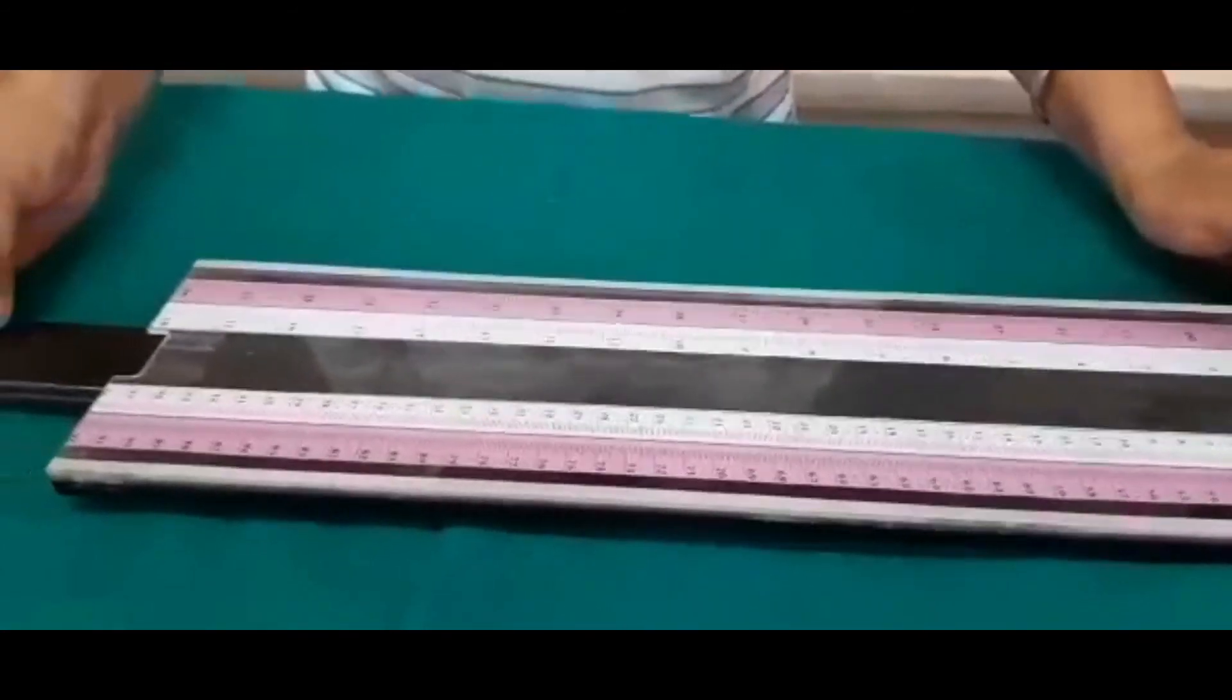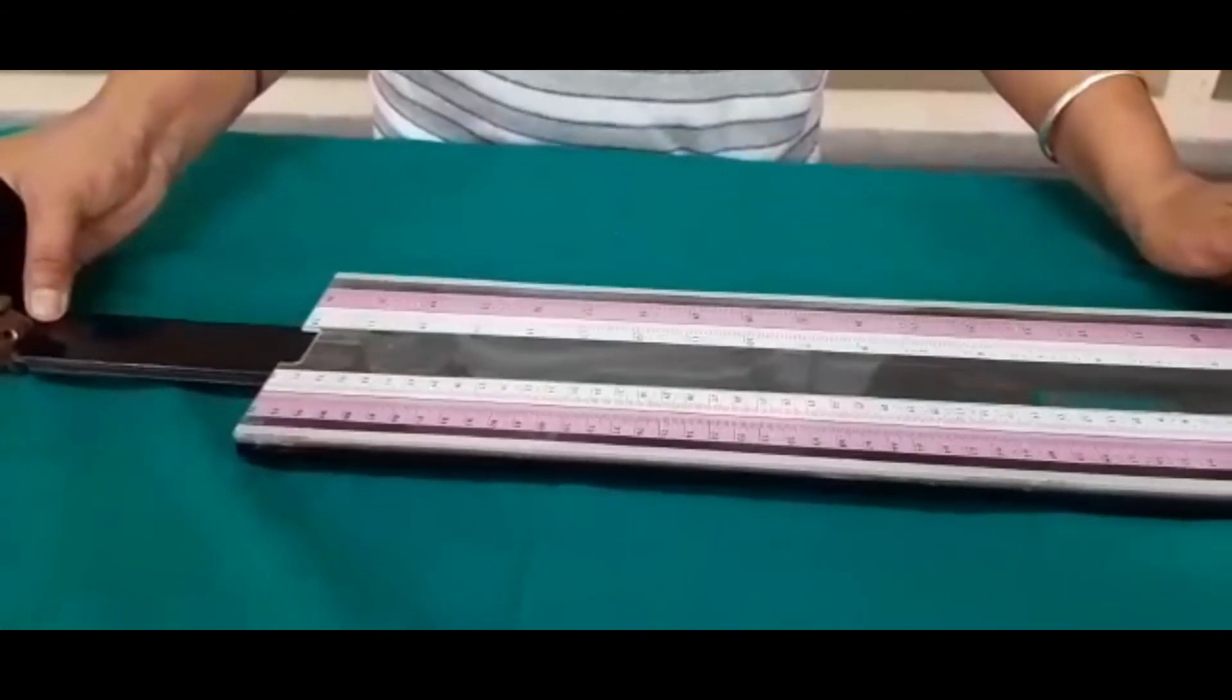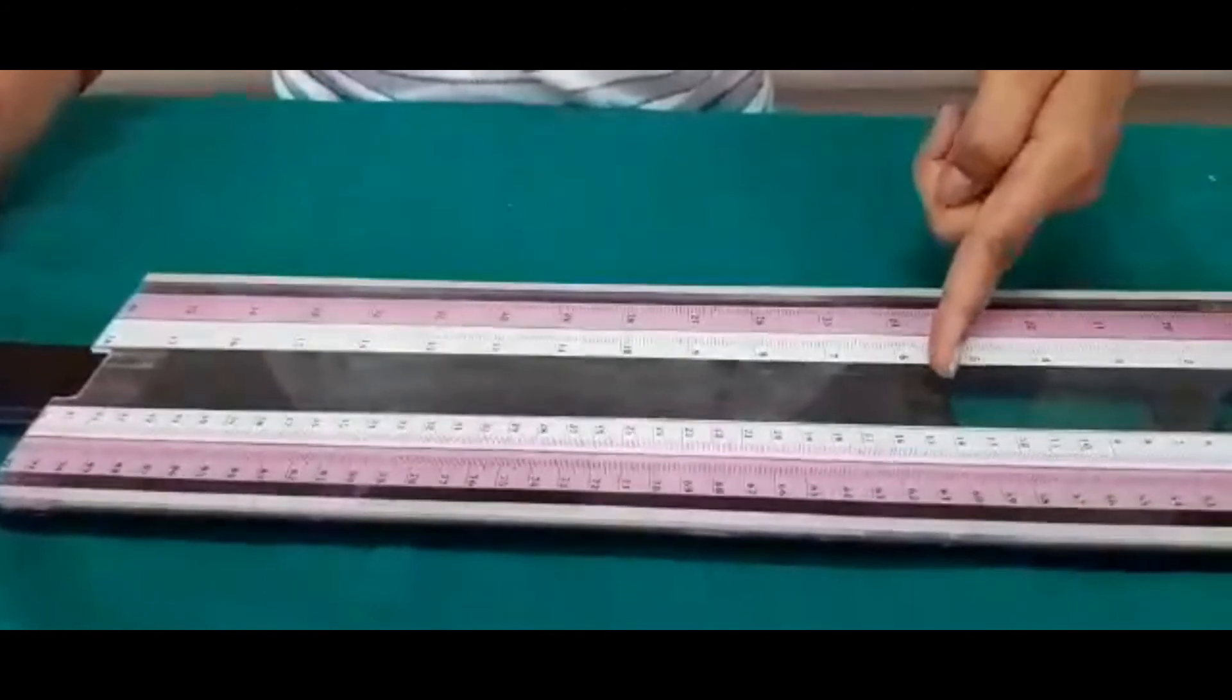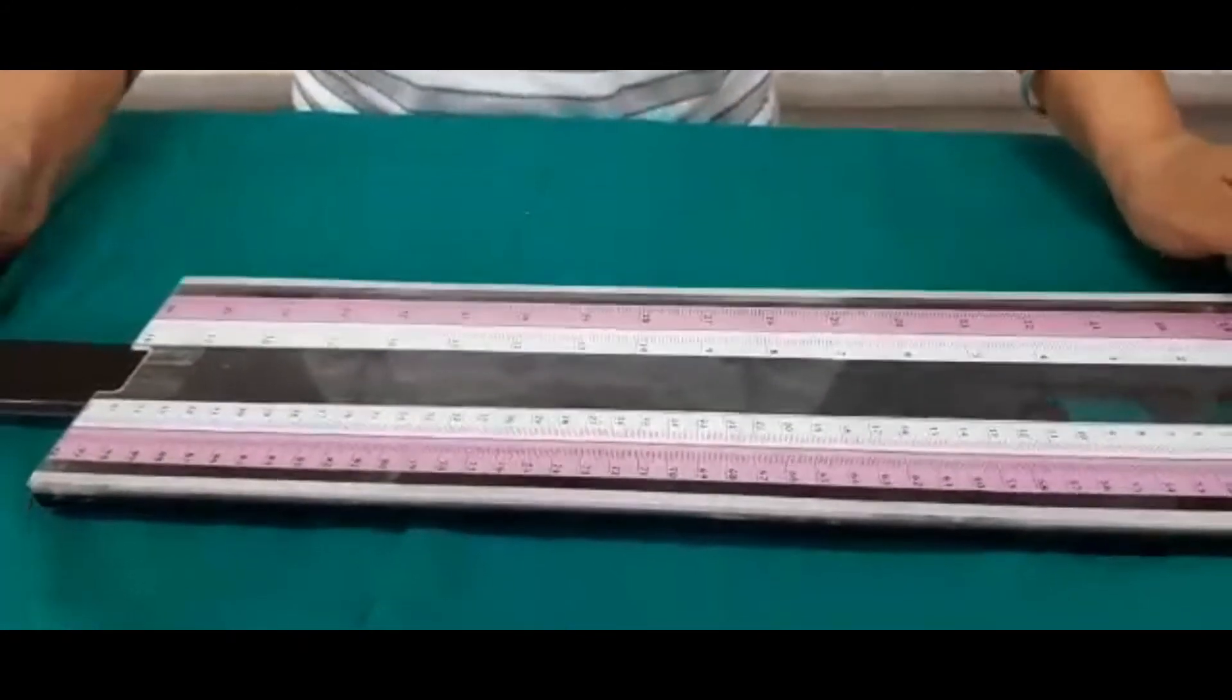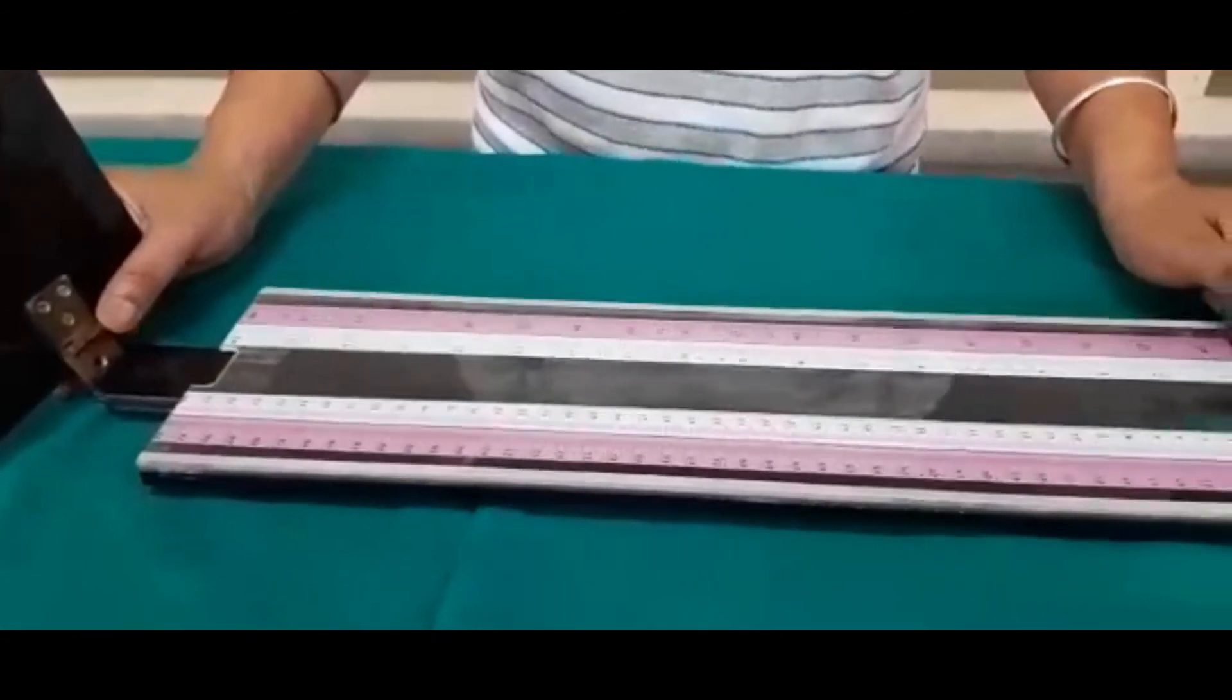And if our baby length is 60, then we can take this scale till 60, and this is 60. This scale helps to check the length of the infants.